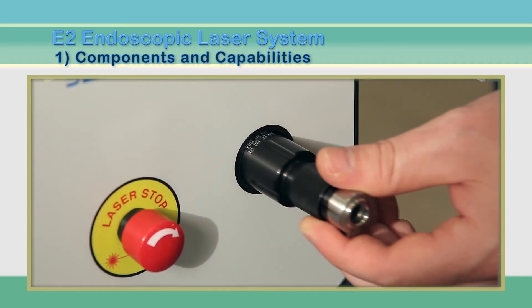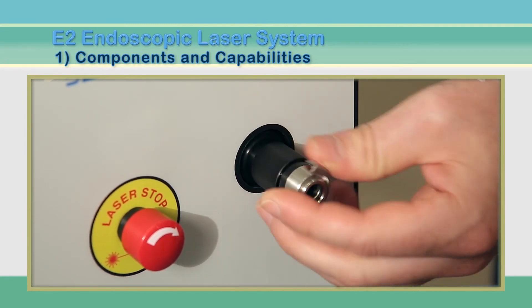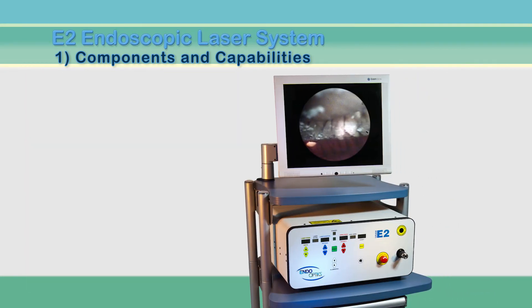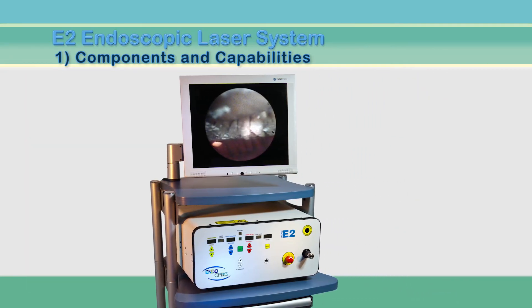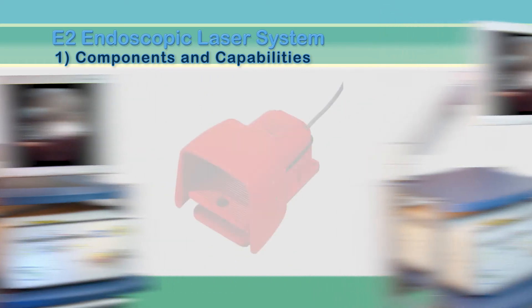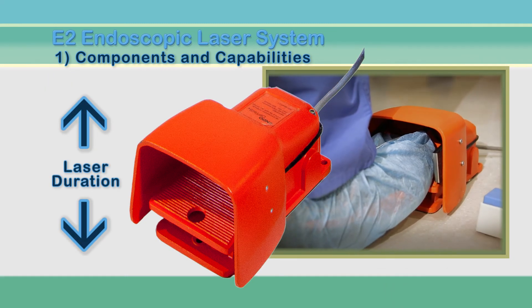A removable video adapter is inserted into the console and can be easily changed to accommodate different endoscopes. The flat screen monitor can be adjusted to provide the best view for both surgeon and operator. A swing arm option is also available for greater flexibility. The footswitch has two variations, the first controlling laser duration only, and another which controls illumination level as well as laser delivery.